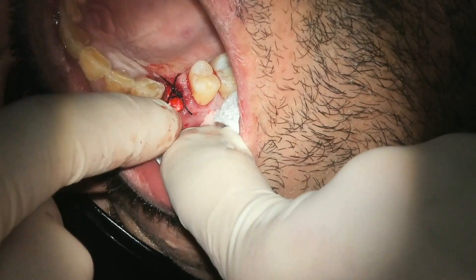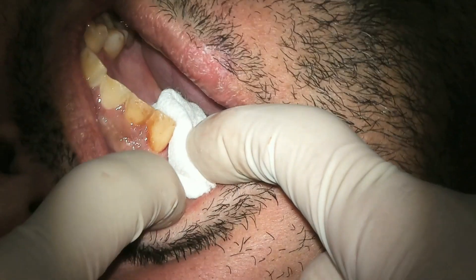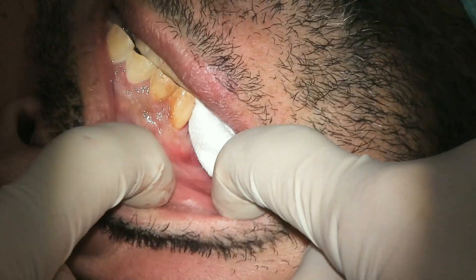Here we place the sutures and have the patient bite down on the gauze. Thank you very much and take care.